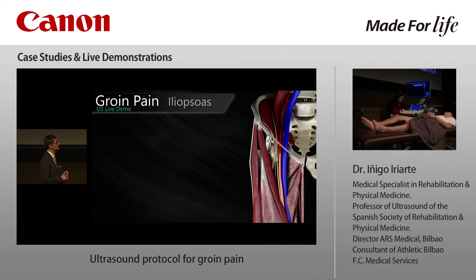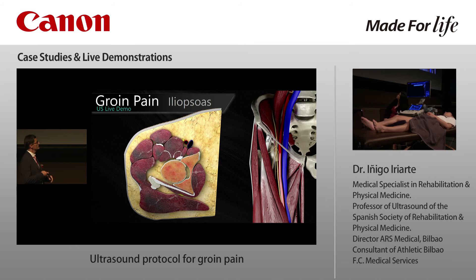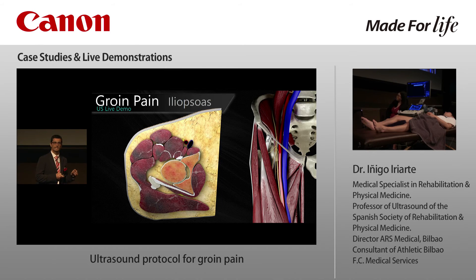We will place the probe over the anterior inferior iliac spine and then move medially. We will find a thick tendon, very close to the hip joint, just beneath. This is the psoas major tendon. It usually has a very small muscle, the psoas major muscle. And lateral, we will find this big muscle, which is the iliac muscle.